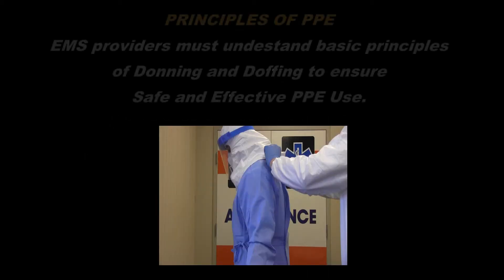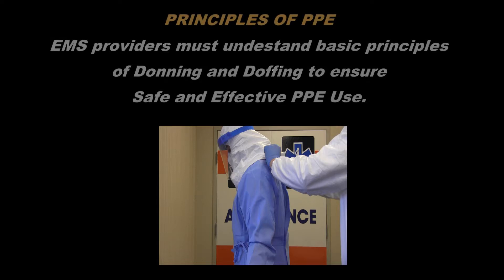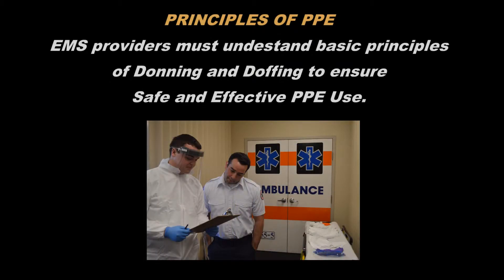EMS providers must understand the basic principles of donning and doffing to ensure safe and effective PPE use. PPE must be put on, or donned, correctly and in proper order prior to patient contact. A trained observer should be used to ensure PPE is donned appropriately. This trained observer may be your partner.